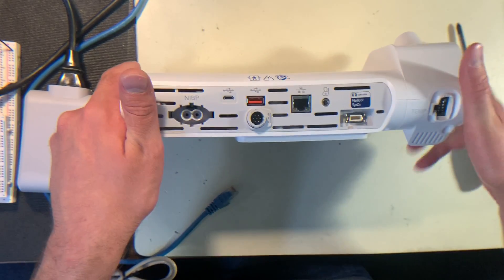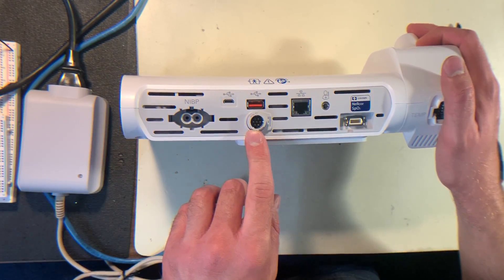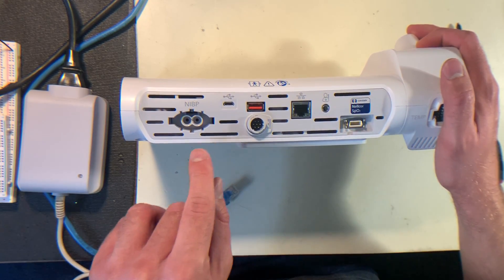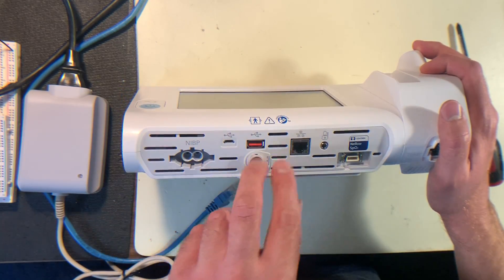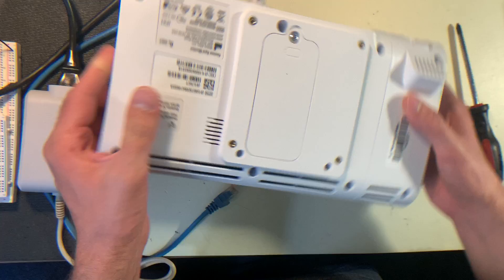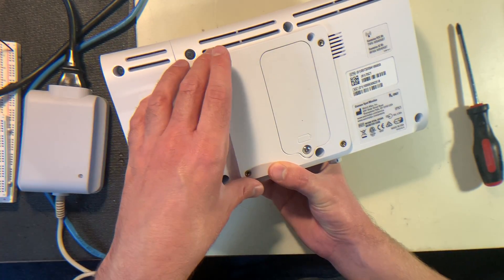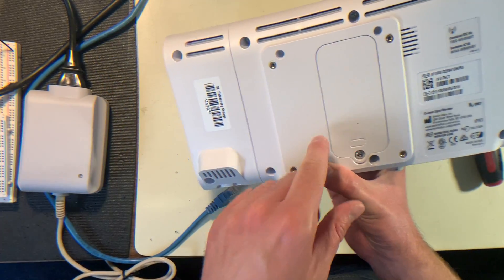On the back here you have the various ports for the device. You have your power port there, Ethernet, the SPO2 sensor would connect there, and you have the blood pressure cuff that would connect there. You also have two different USB ports. On the back here you would have the mounting points for a bracket that would hold it onto a pole — I currently don't have one of those, but this is where it would attach to.